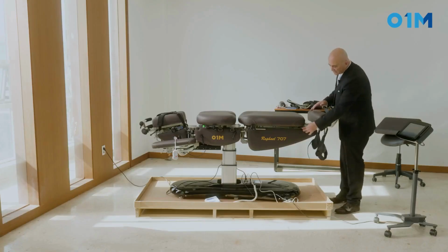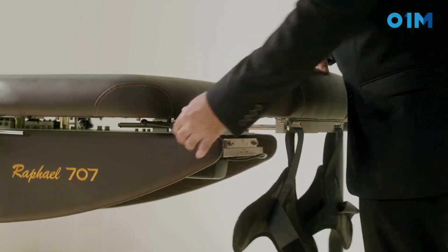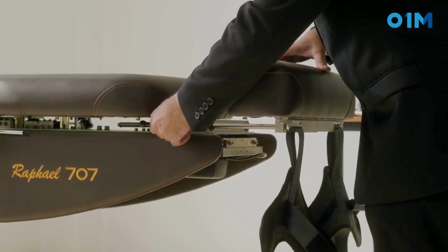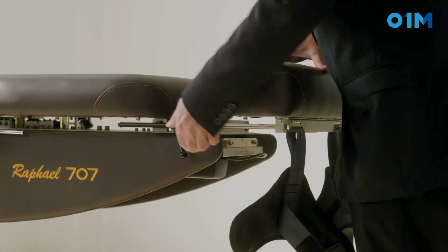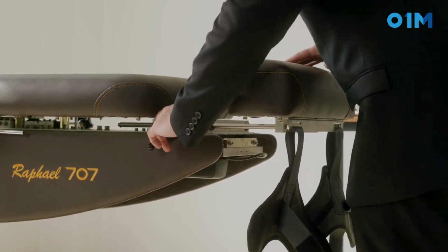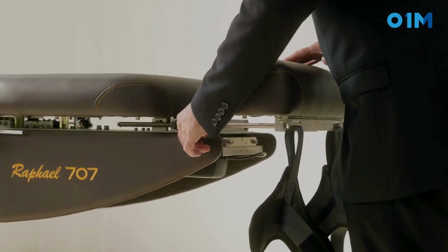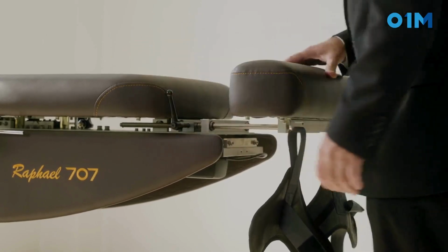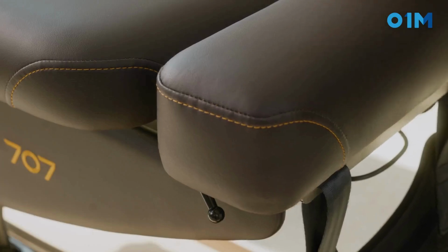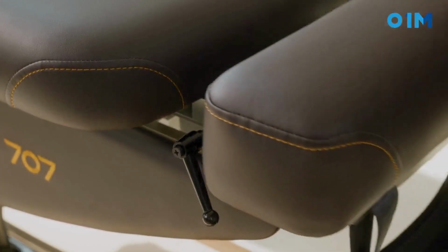You have a self-adjusting auto lock. If you cannot lock because the bracket just hit the table, you're going to just pull it, bring it down, and then you lock it. So pull it, move it away, and then you can lock it. Open it up again. Very, very smooth mechanism. One finger will push down the foot piece.